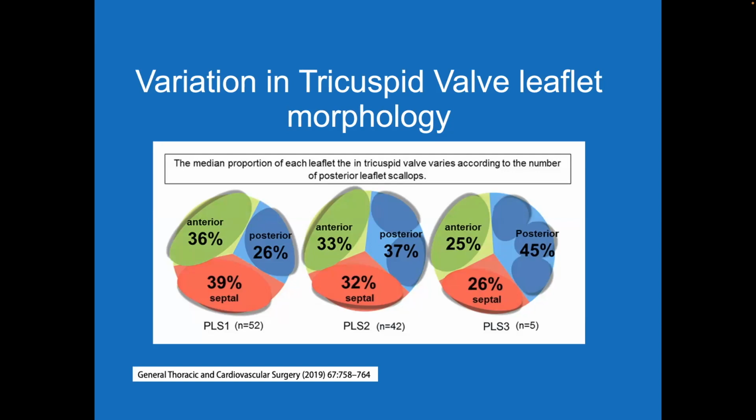A lot of this is scalloping and separation of the posterior leaflet. Luckily, since the majority of the patients have a 3 or 4 leaflet valve, early work suggests that clinical outcomes of edge-to-edge repair between 3 and 4 leaflet configurations are similar.